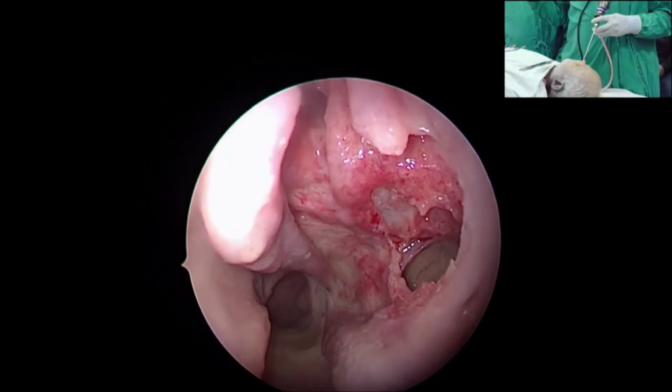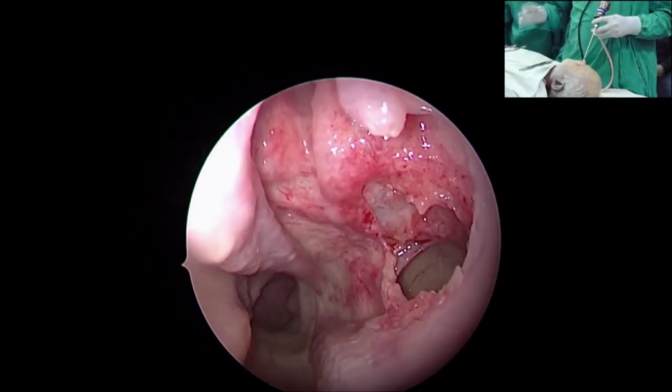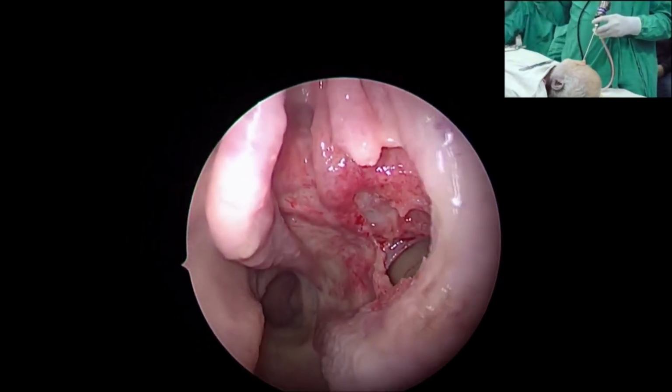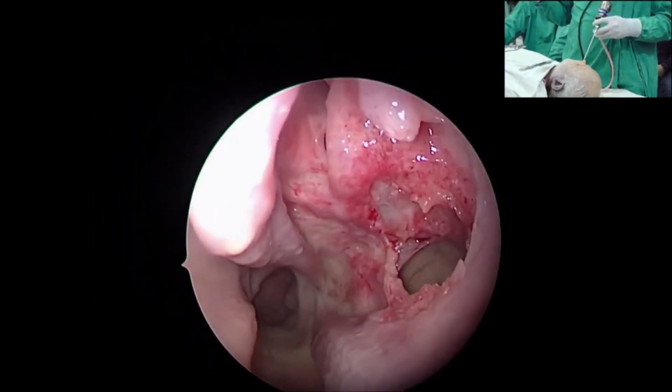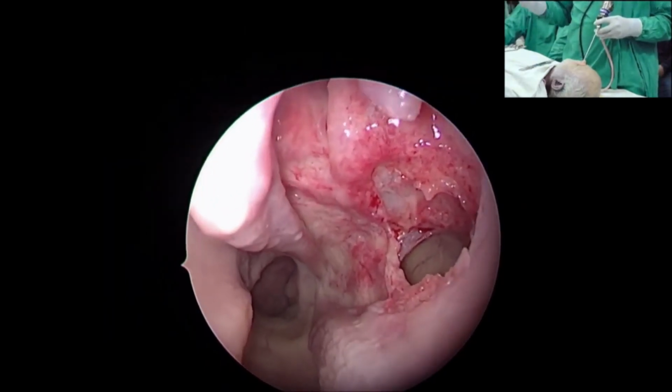Lesions of the orbit, particularly the medial lesions, the best approach is endoscopy in the present context with minimum morbidity. And not only that, the skull base. Not only lesions of the skull base, benign or malignant, whatever, but it has become a preferred approach for many of the intracranial lesions now.